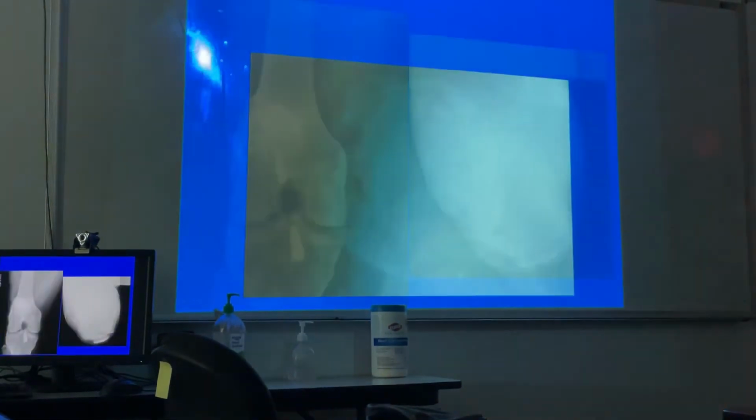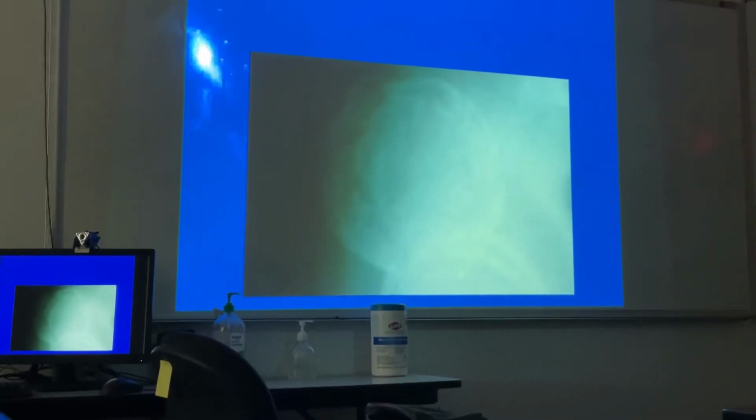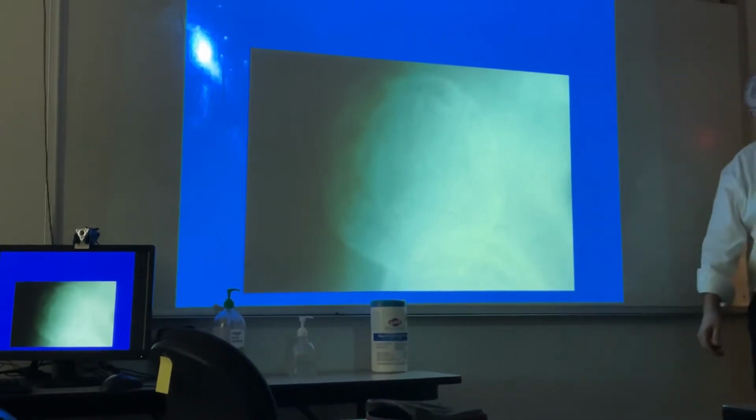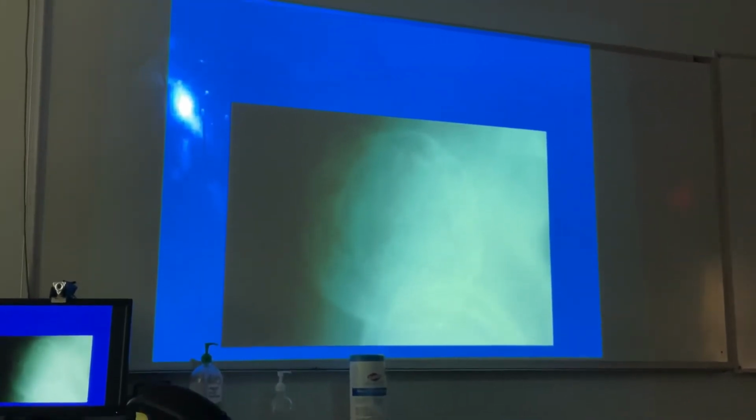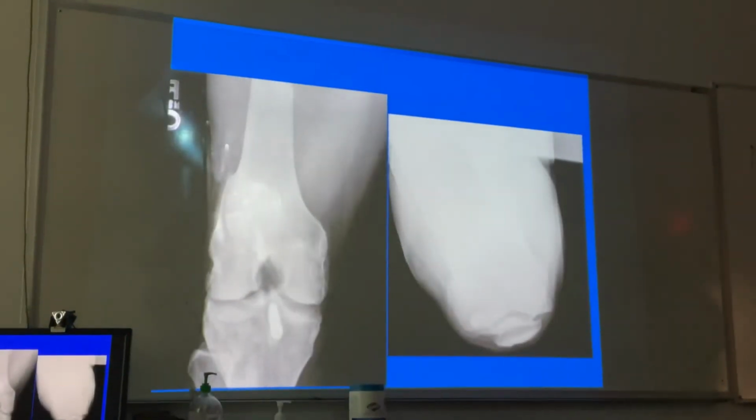I know what it is because I took the picture. I'm trying to give you some kind of context. This is a large uterine fibroid. Where's the uterine fibroid? In the uterus. Where's the uterus then? Pelvis. Thank you. And then we said the follow-up imaging for a small, medium, or large uterine fibroid is what? Ultrasound. Diagnostic ultrasound, okay? All right, this just happens to be a big one. I should have the full lumbar x-ray, but I didn't, okay?